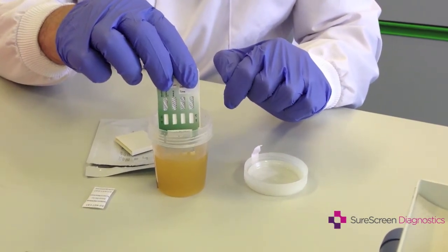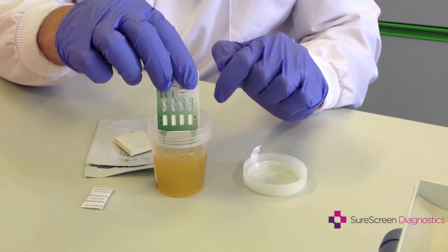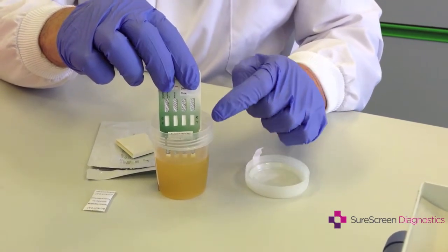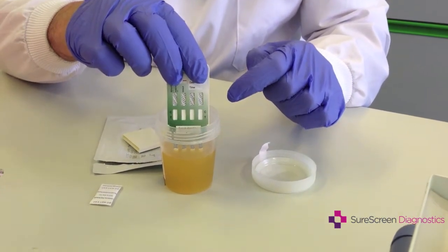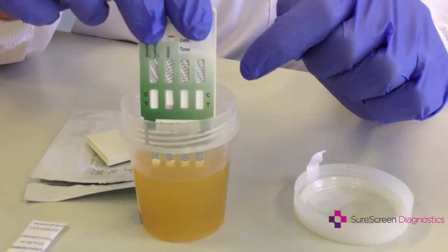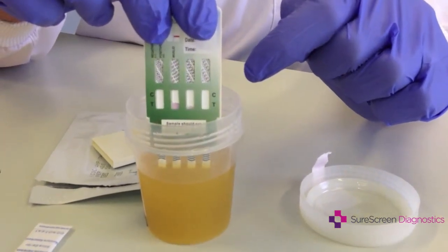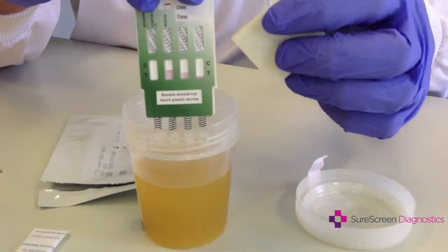Leave it in the sample for between 10 to 30 seconds for the sample to be absorbed. You will see it start to wick up the test, carrying a red dye with it, and you can then remove it from the urine sample.